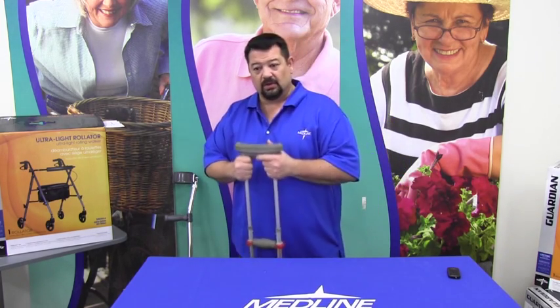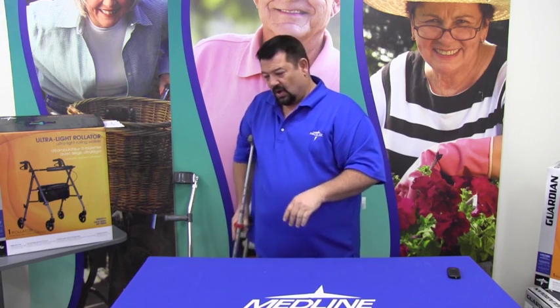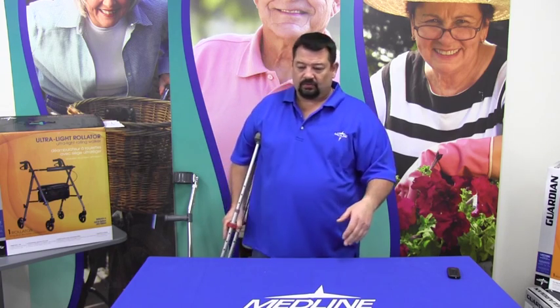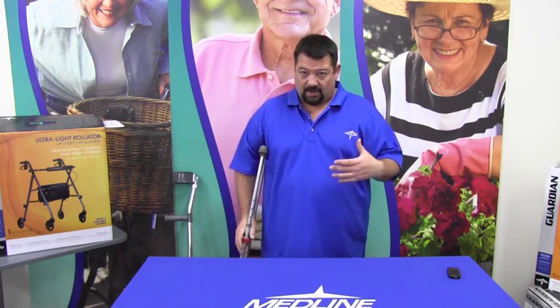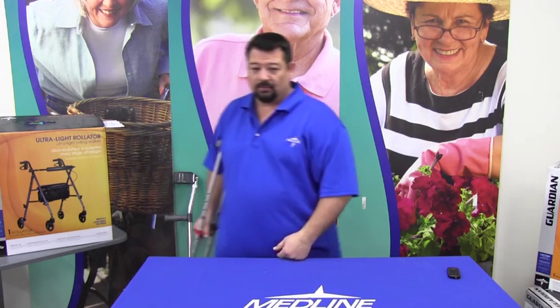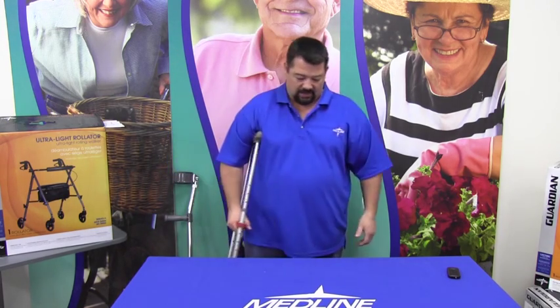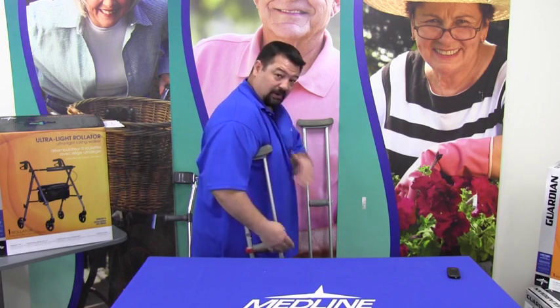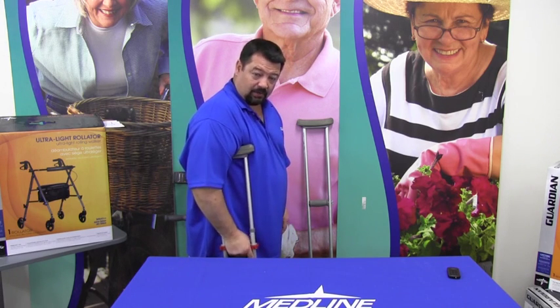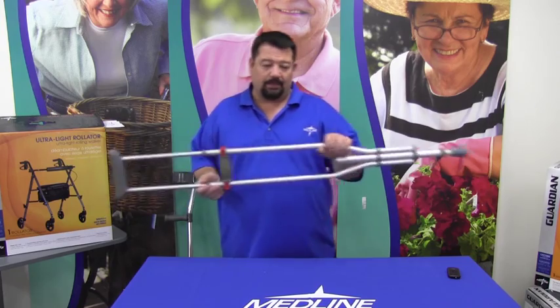The crutches are designed to be used either singly or in pairs. And singly, very similar to the cane, you want it to be on the opposite side of the injury. On a regular pair of crutches, when you're using both, it doesn't matter. The object is you want to do crutch, step, as opposed to planting the crutches, swinging your feet out, and then bringing the crutches in. The idea is that you want to have the weight slightly back and the crutches slightly forward and even out a bit. So when you walk with the axillary crutch, it's going to be out and then making up the gap. Very, very important.